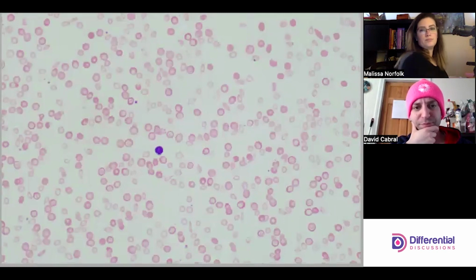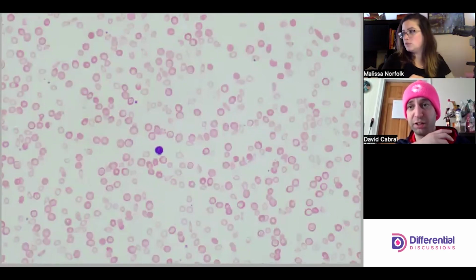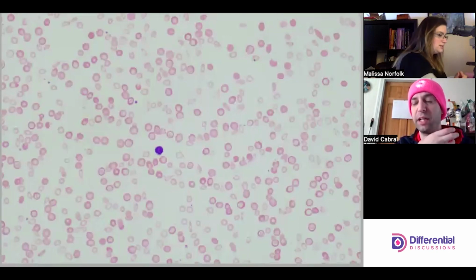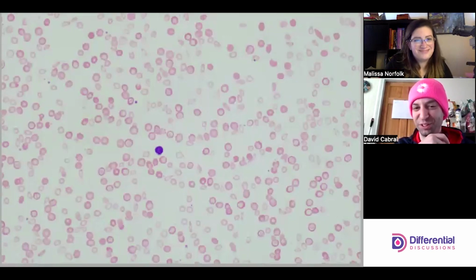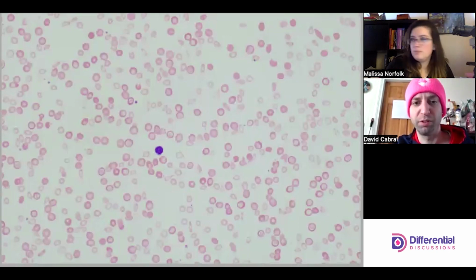In other videos, we may have talked about the lymphocyte, specifically the resting lymphocyte and its utility to the morphologist. The resting lymphocyte ends up being an excellent visual anchor for gauging roughly the size of the erythrocytes. So now I can see with this lymphocyte in the field that the large population is probably a quite normally sized population, and that we actually have a super microcytic population that's giving us this visual, I don't want to say illusion, but we misperceive the reality here. Really cool. We'll see more when we go down to 100.